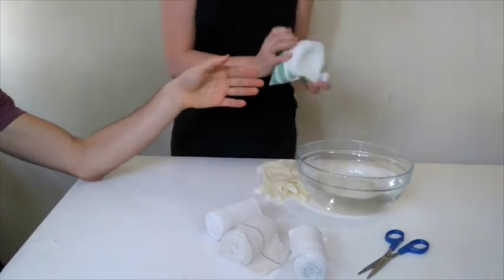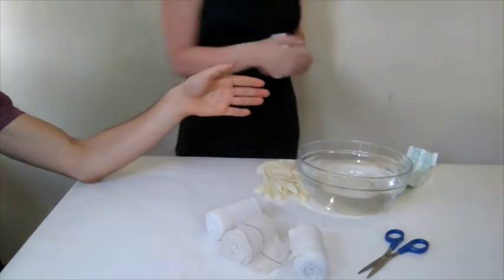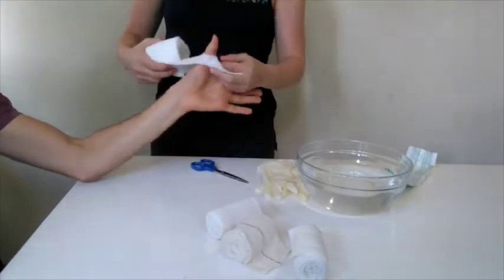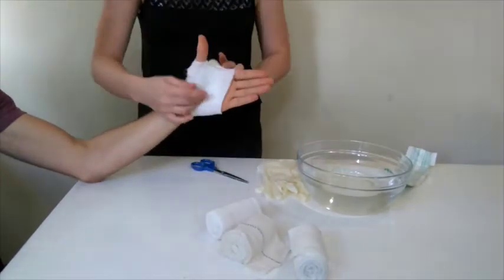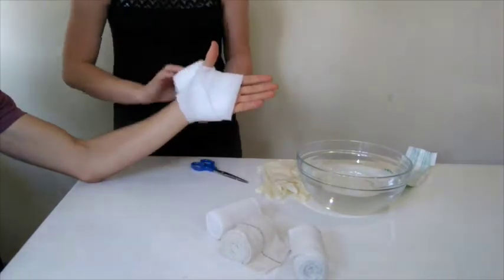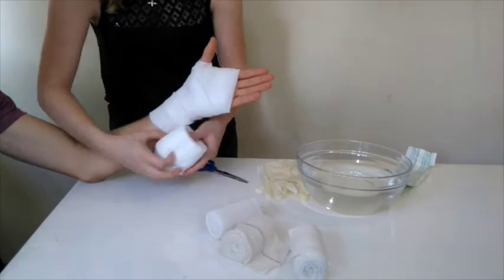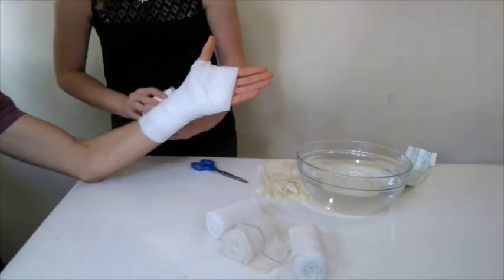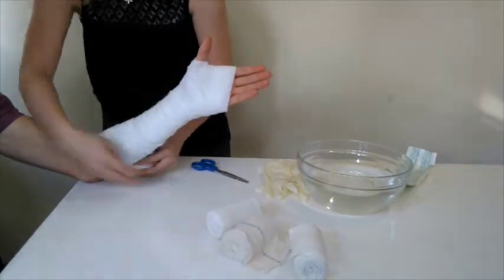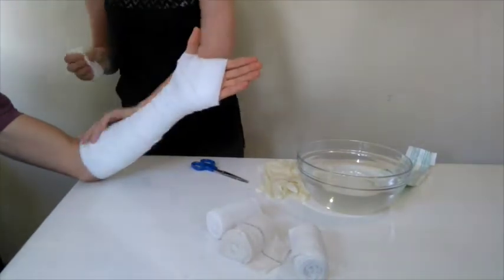When applying the padding, start at the distal end of the arm. Make a small hole to allow for the thumb and then go through the first web space twice before moving proximally. As you work towards the elbow, aim for a 50% overlap between each layer of padding. It is important to note that the padding should be rolled onto the arm, not pulled on. When you reach the antecubital fossa, wrap the padding around a second time and then tear off the excess, as shown.